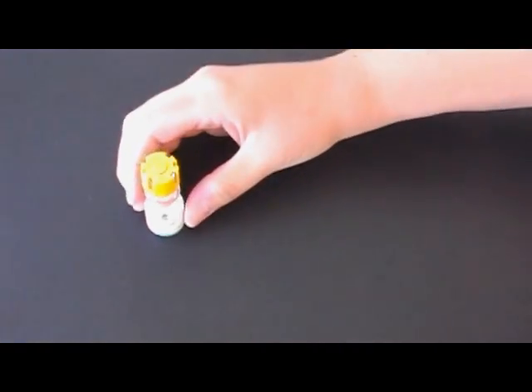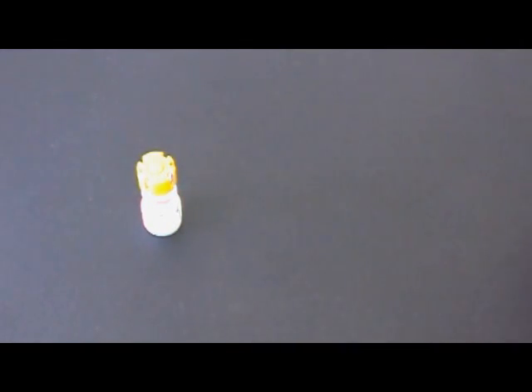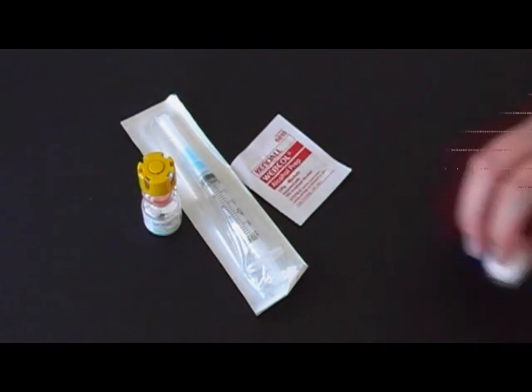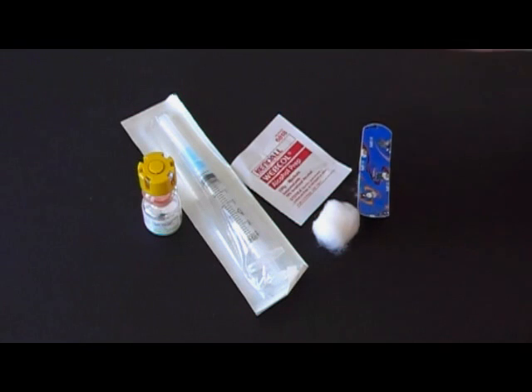The items that should be in your emergency kit are the Solu-Cortef vial for injection, the needle and syringe, an alcohol swab, cotton ball, and band-aid.